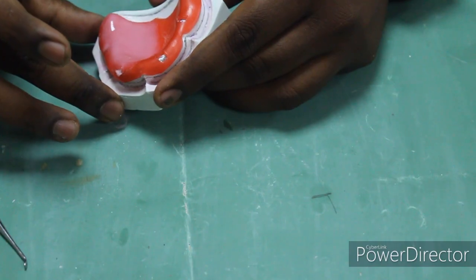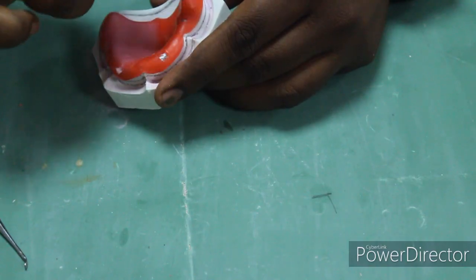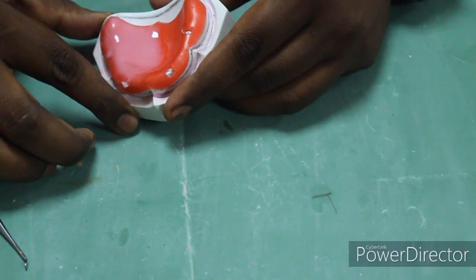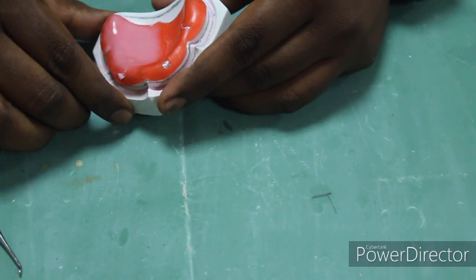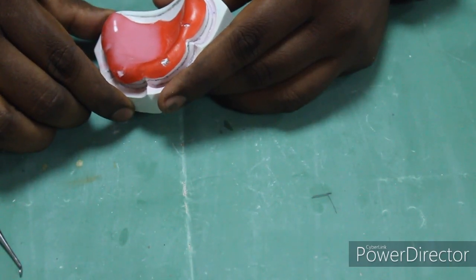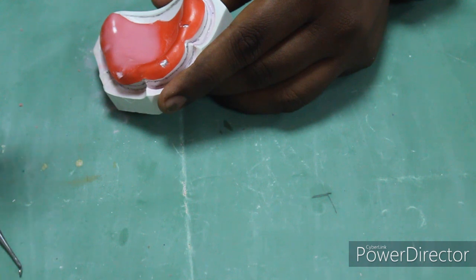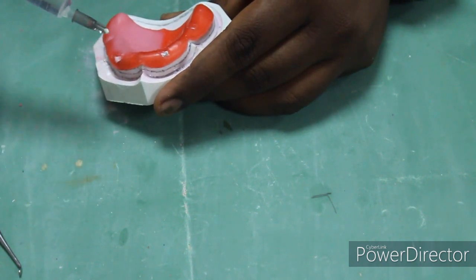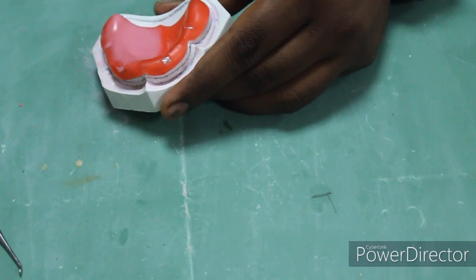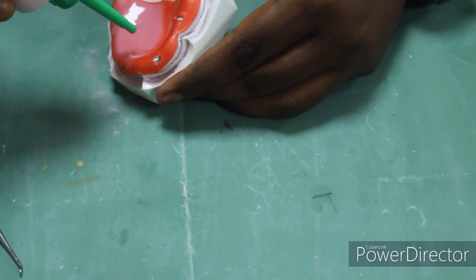So once it sets, then you can alter the position of the cast, and then you can add incrementally onto the entire surface of the desired tray outline. So if excess acrylic resin is flowing away from the proposed tray outline, you can remove the excess and readapt it onto the deficient area. So like this you have to add incrementally and fabricate the custom tray.